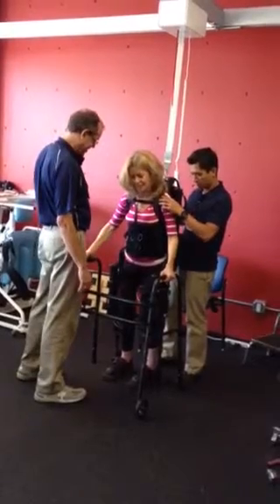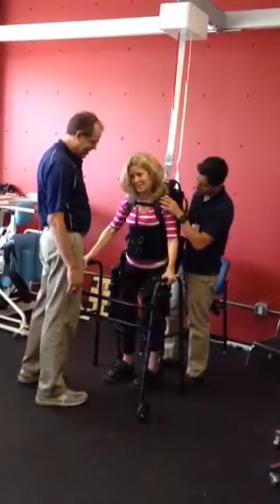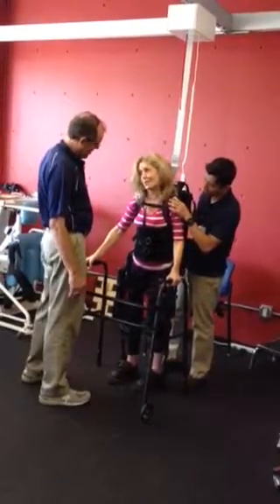Scary. Can you see a little bit? Yeah. You're not lightheaded or anything? No. Okay, good.